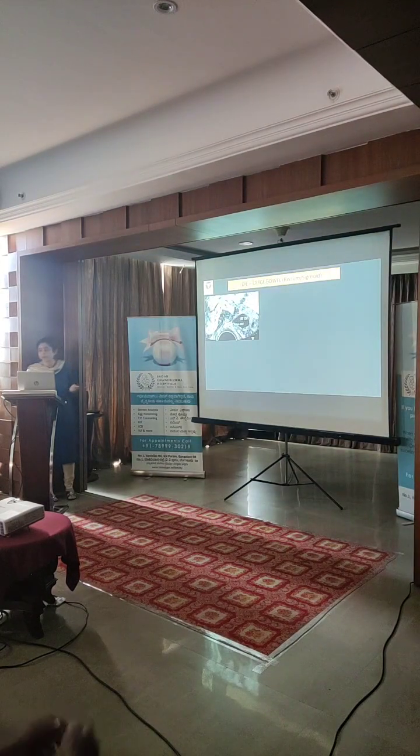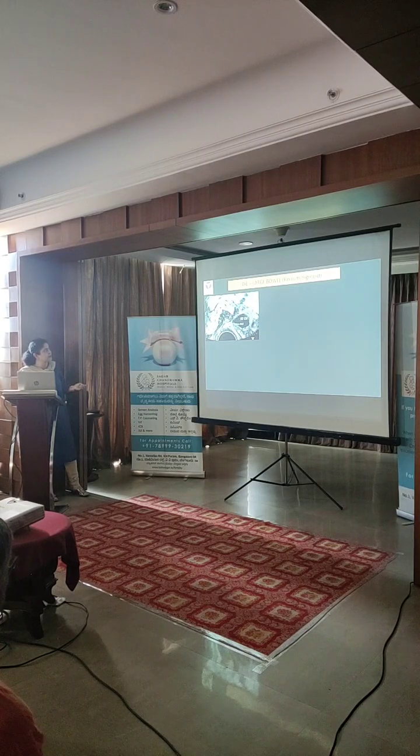Now let's look at, I'm not going to go through the entire spectrum, but large bowel DIE is very commonly seen, and this is how it appears. This is the DIE lesion. If you look at the normal anterior muscularis, you see a thin white line over here, and this separates the inner circular from the outer longitudinal fibers, and in the area of the DIE, you see that the whole anterior muscularis is thick, and this hyperechoic line is not seen.